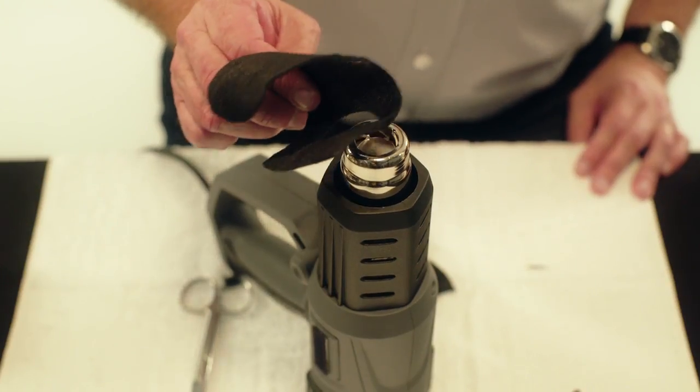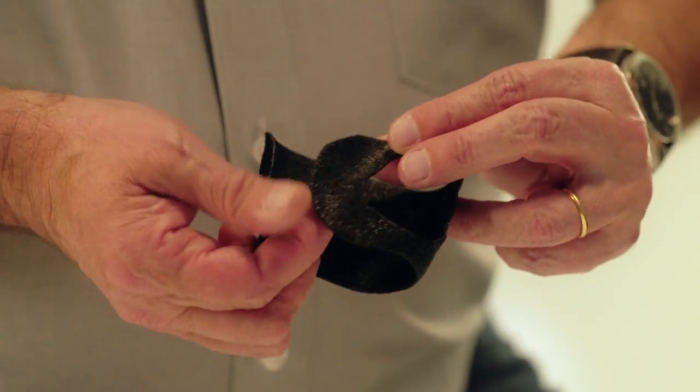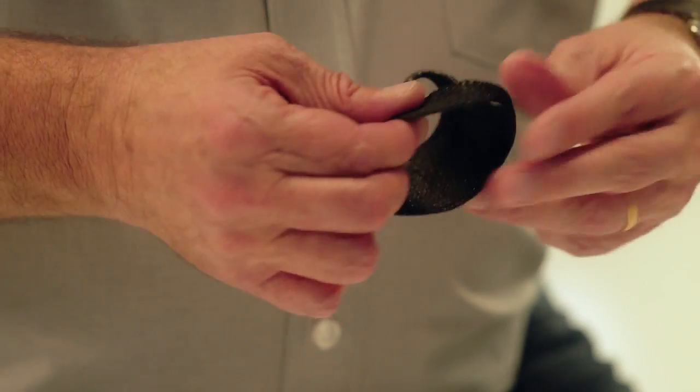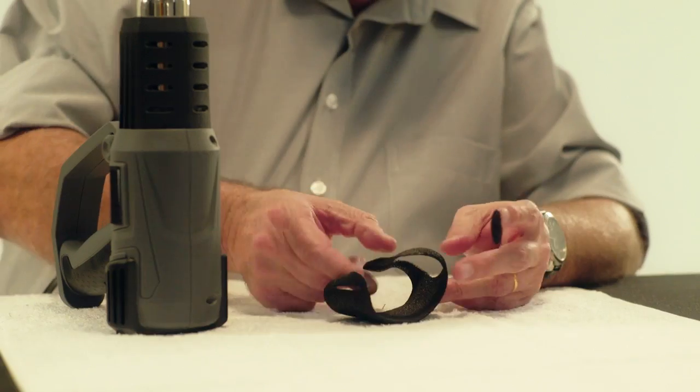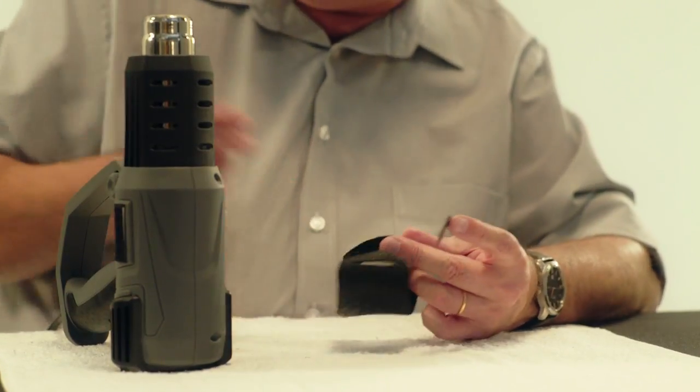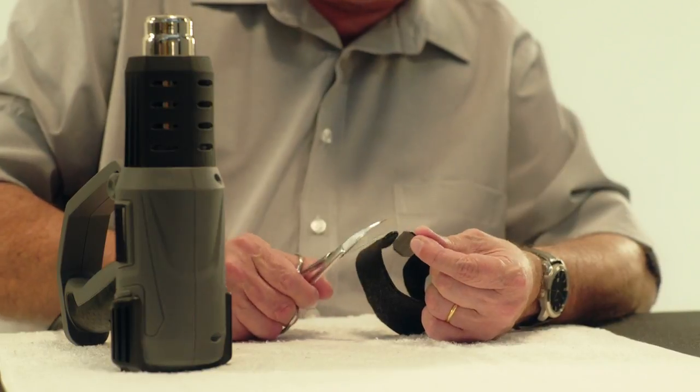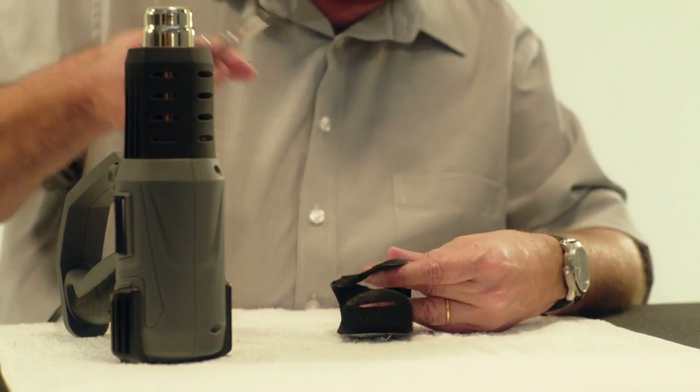Heat the edges of the thumb opening and fold outwards and smoothen. Attach the self-adhesive Velcro hook by heating the orthosis on the dorsal surface and the glue side of the Velcro hook with the heat gun and press firmly together.